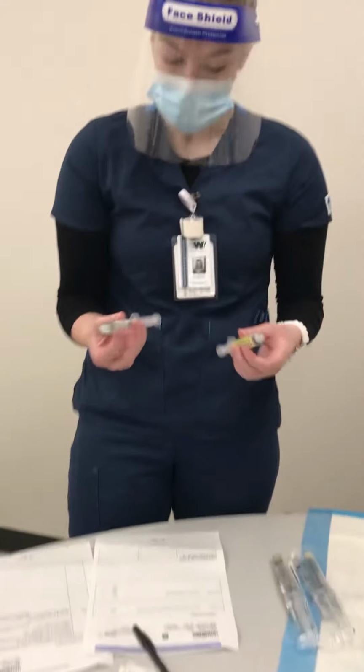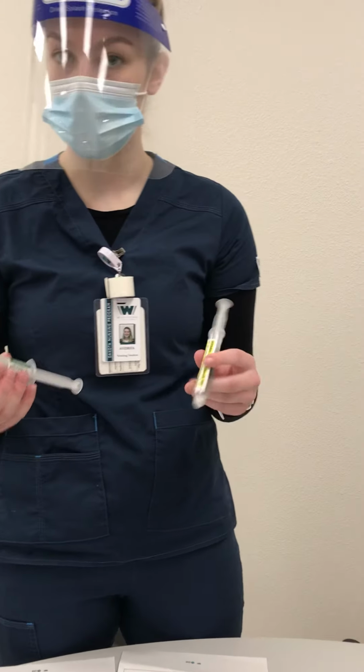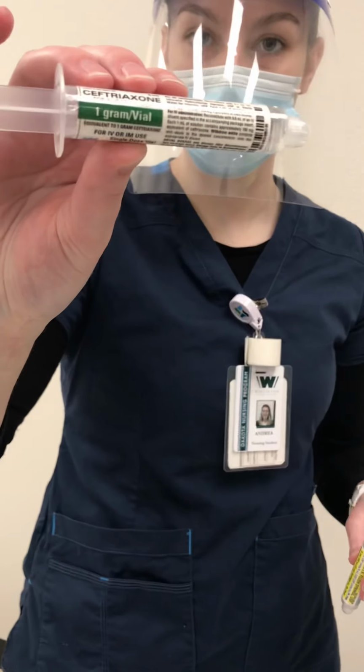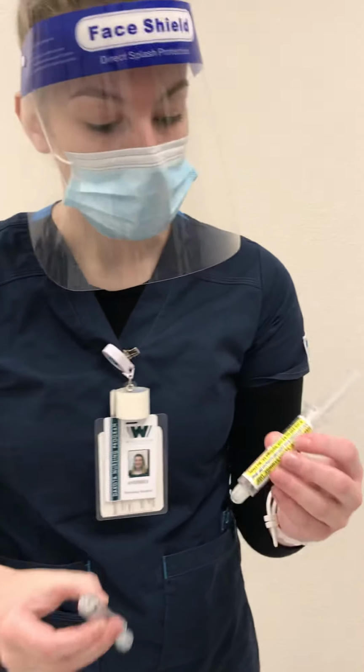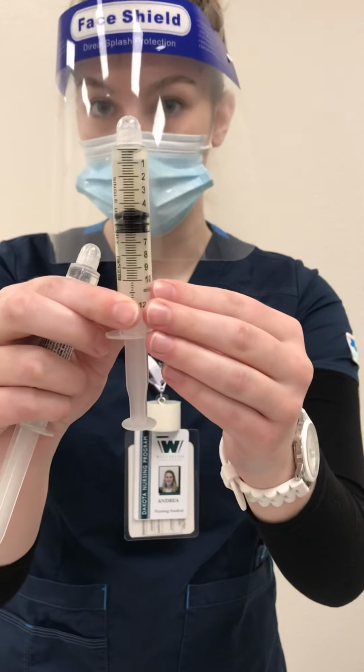Before I leave the med room, I'm going to do a second check as well. I'm also going to get it verified with a nurse. So my camera person is going to verify that I have ceftriaxone 1 gram, and that is at 10 milliliters. And then that I also have heparin, and that this is set at 5 milliliters as well.